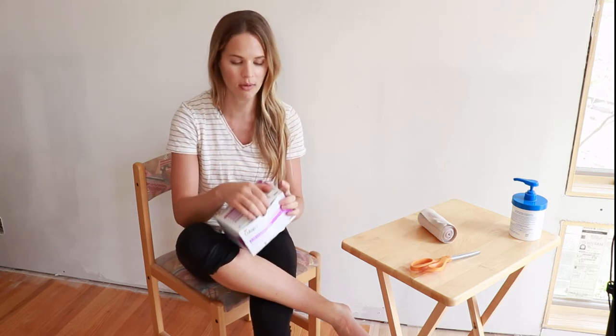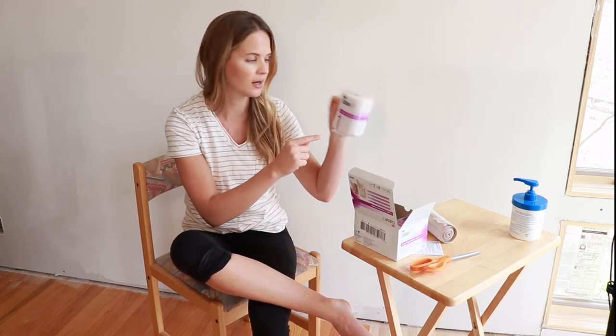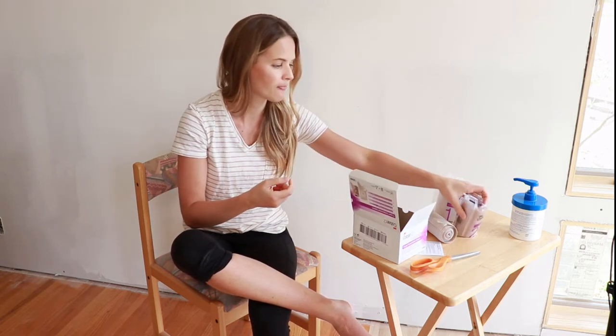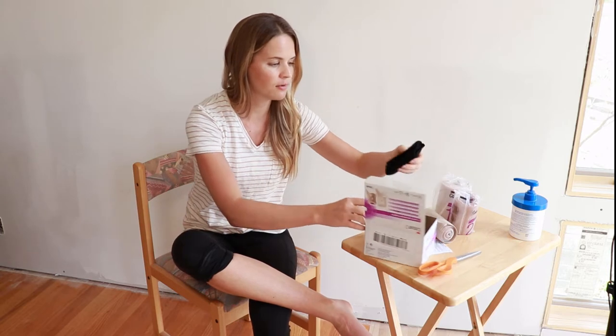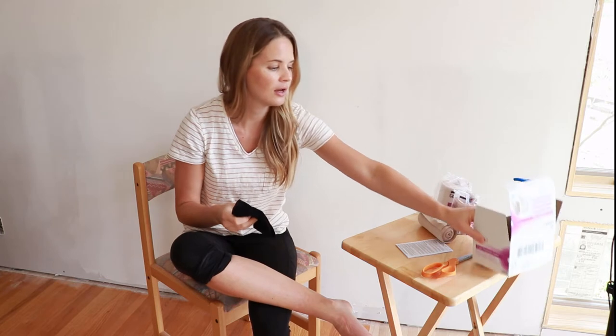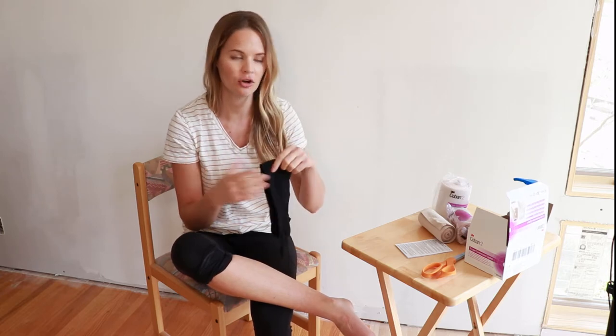In your box of Coban you're going to see three things typically: layer one with the number one on it, your layer two with the number two on it, and then most should have a liner stocking. That's because layer two is very sticky and you stick to everything including your bed sheets. If you have a pet, this thing attracts pet hair like crazy, so the liner is nice to put over the top so you don't feel that.